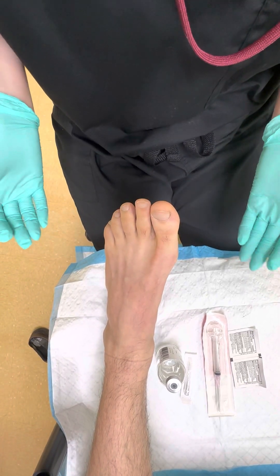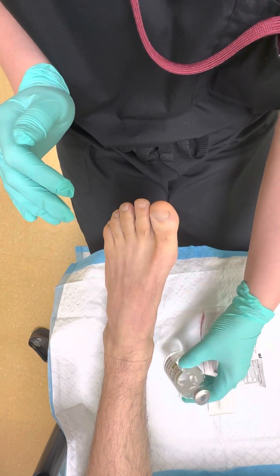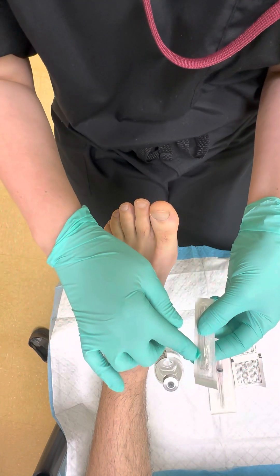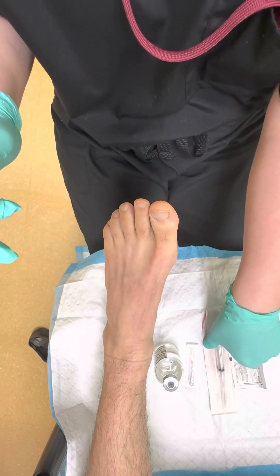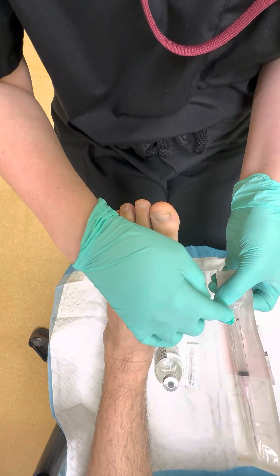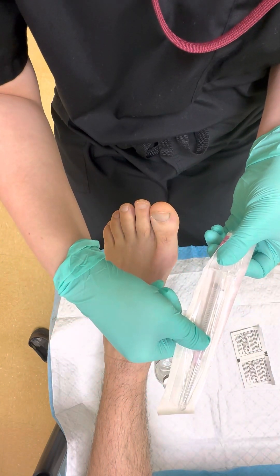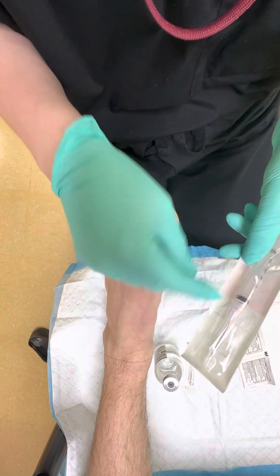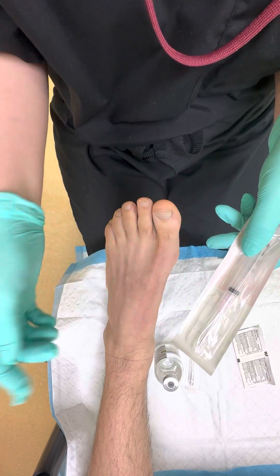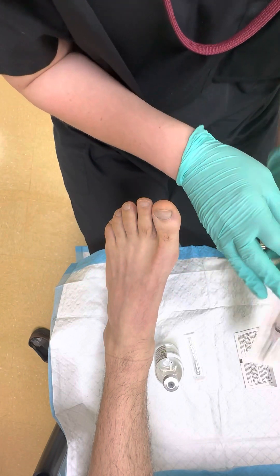We're going to demonstrate a hallux block. You have to make sure you have your materials ready and that the local anesthesia is not expired. For a hallux block you can use a 27 gauge needle — from this company it has a gray cap — and a 3cc syringe with an 18 gauge needle to draw up your local. Sometimes the syringe and drawing needle are packaged separately, but today they come in one pack.